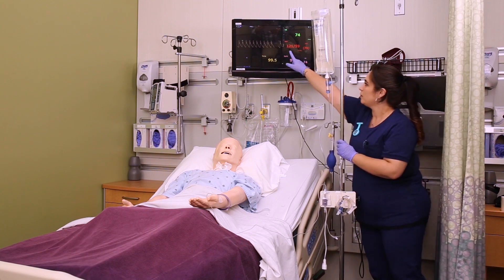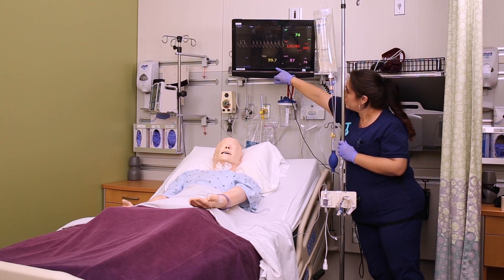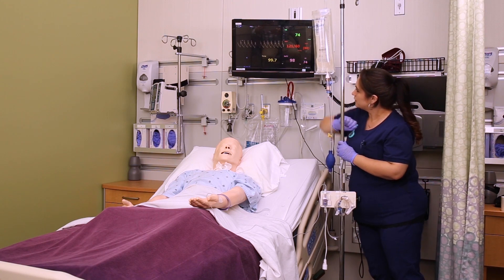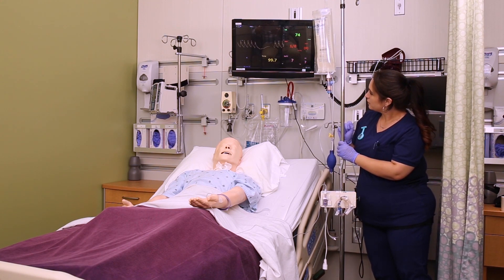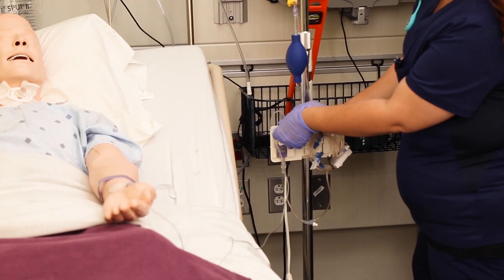Once you're level, you can zero the transducer system. Turn the stopcock off to the patient, remove the cap keeping it sterile, to open the system to air — so off to the patient, open to air. Then on the monitor, select the pressure waveform and select zero.